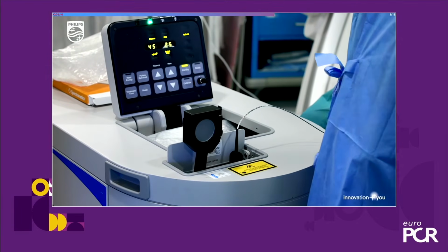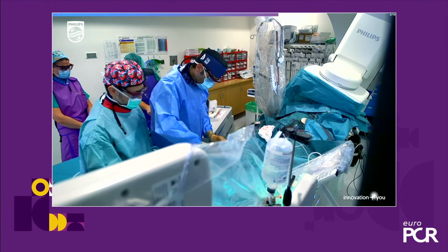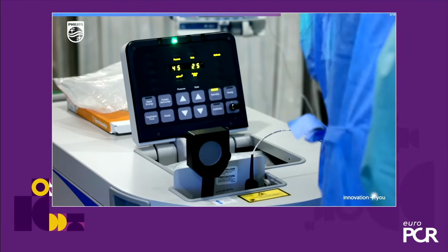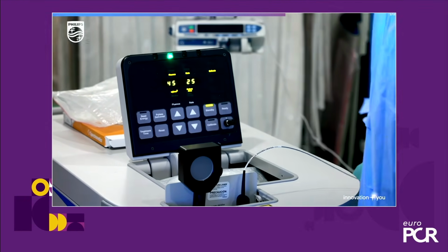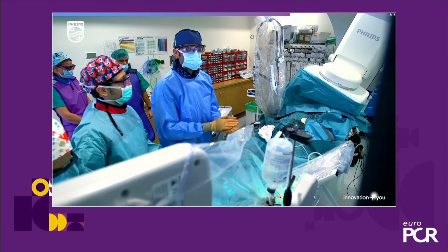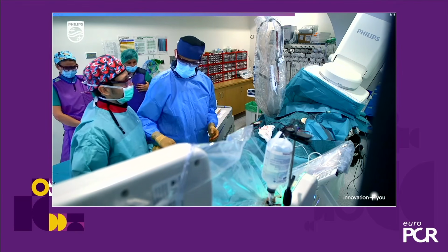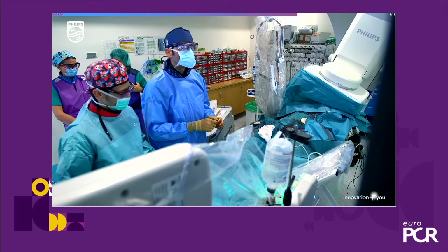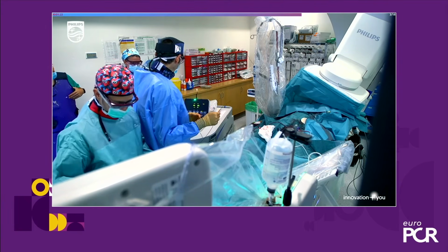We use this technique, the practical technique of using a Mosquito just to maintain the laser catheter here. And we have to do both things. We have to calibrate the console. This job is done before by our nurses with a non-sterile catheter, and then we need to calibrate the sterile catheter. This second part is performed by the operator.